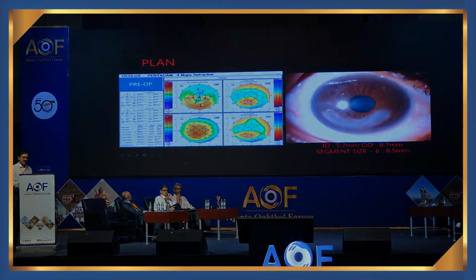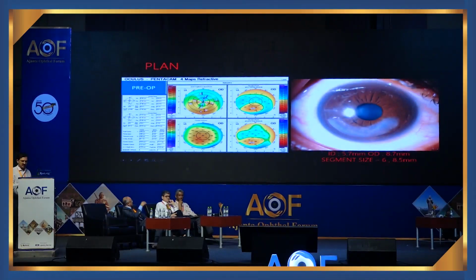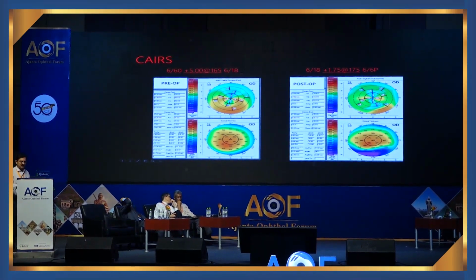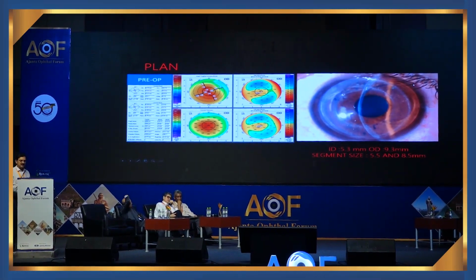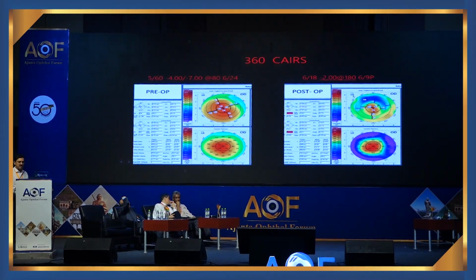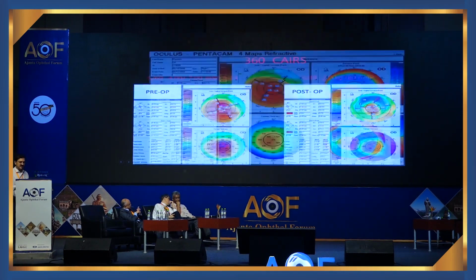These are the results. This is the inferior cone. This is the pre-operative topography, and post-operative topography. You can see very good regularization. And this is the 360 degrees for a central cone. This is the pre-op one. This is the post-op. Here we erred a little bit. We over-corrected and it became flatter, but visual acuity improved nicely in this case.